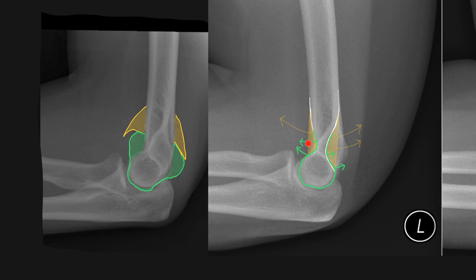The anterior fat pad is already visible on the radiograph, but what happens is it becomes a little more steep from its original shallow position. This is nicely demonstrated by the diagram here on the left.